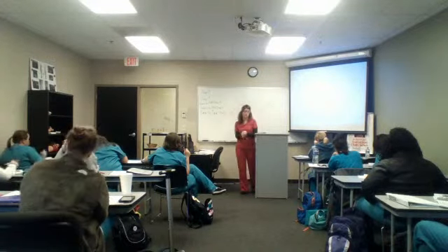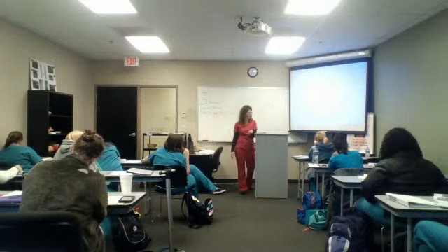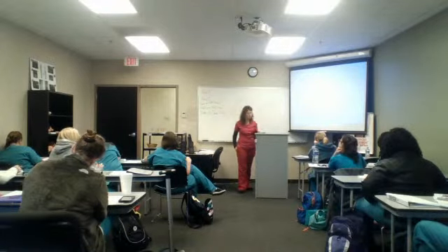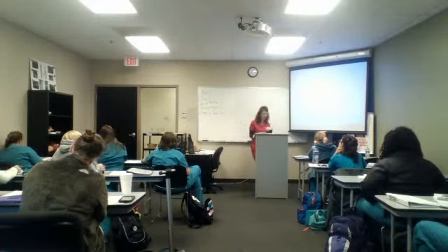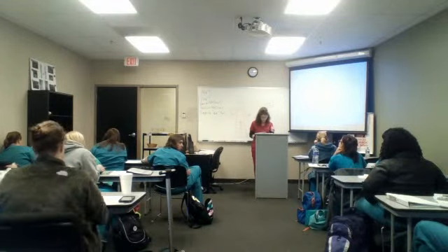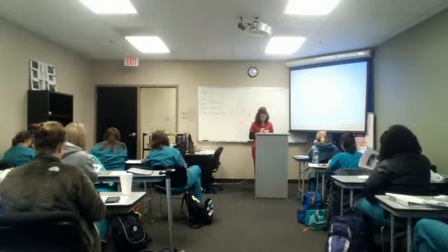You can also have a trifid system. I've seen them up to 4 times. You know, so it can get tricky if they have more than the normal. But if they have 2 veins, both veins need to be looked at, just like if it was just normal 1 and 1. Okay? Everything still needs to be looked at. We'll come back to the bottom of page 98. Go on to page 99.